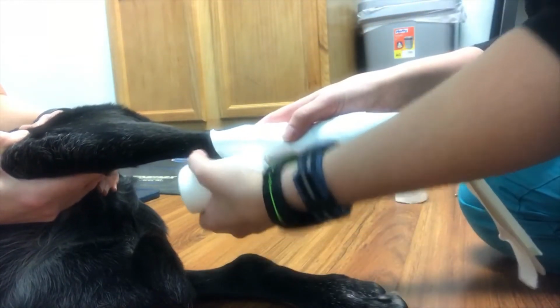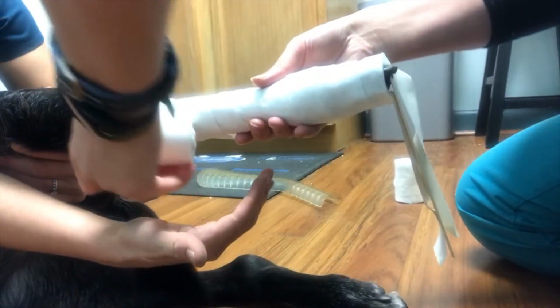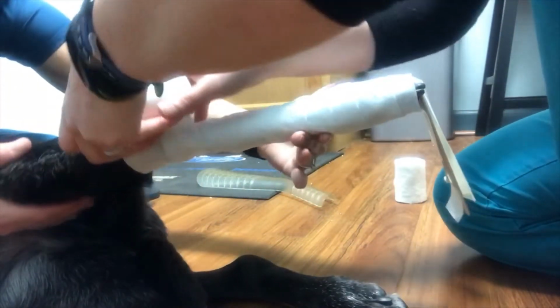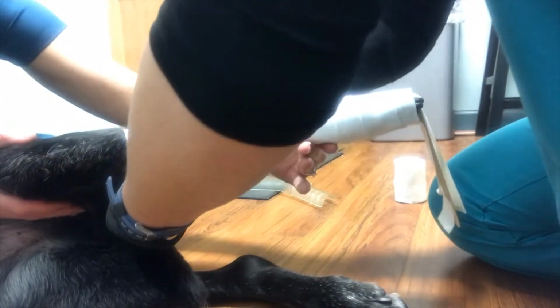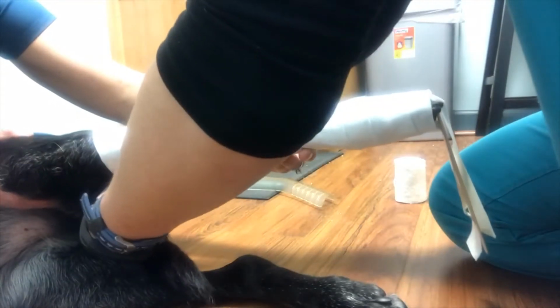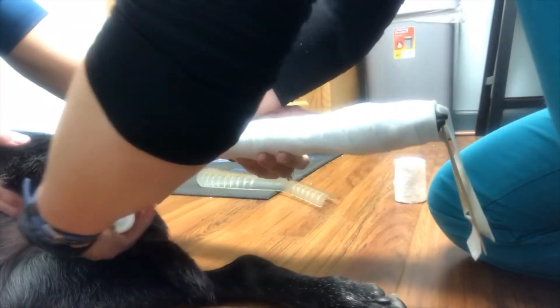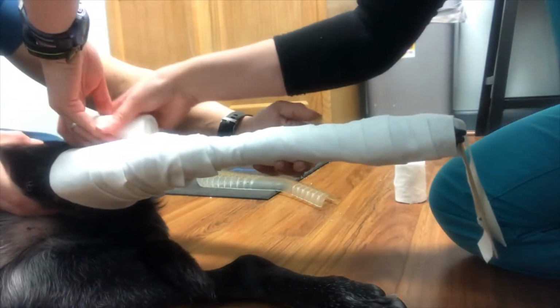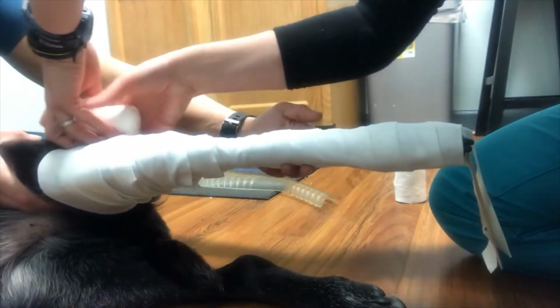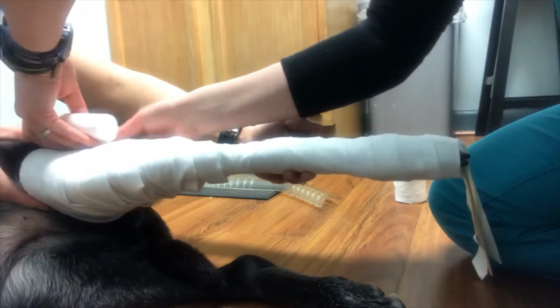There are key areas that you want to make sure have a little bit of extra padding when you're placing the splint, such as places where there's going to be more pressure points. That's to help prevent pressure sores and causing further wounds or damage to the limb. For the splint, I'll have to go higher up the leg. This type of splint would be appropriate for a fracture of the metatarsal area. With a fracture, you want to make sure you splint the joint below and the joint above to help provide full stability.